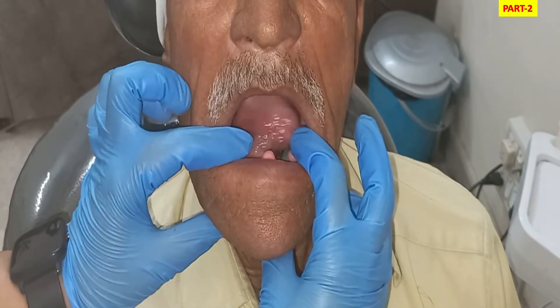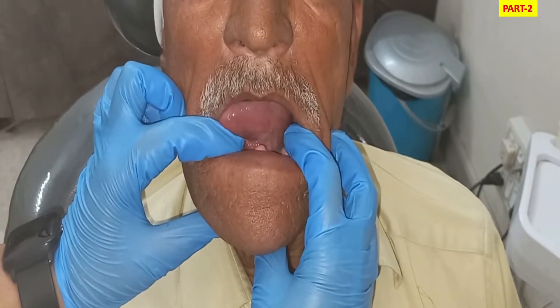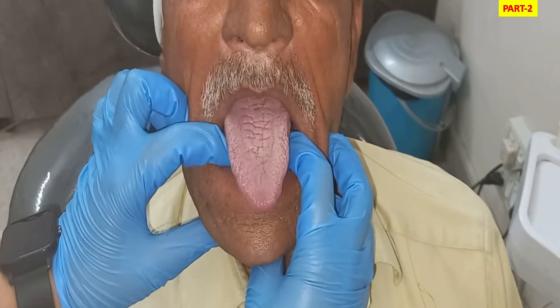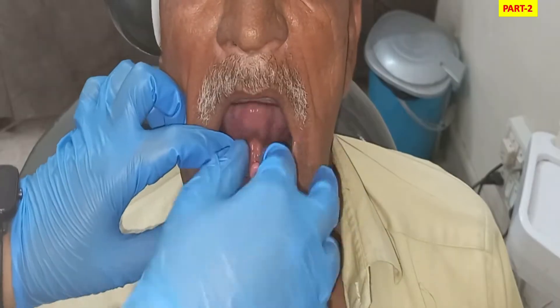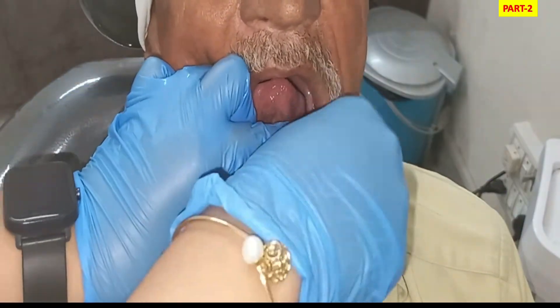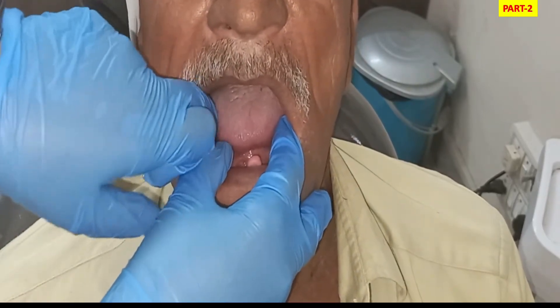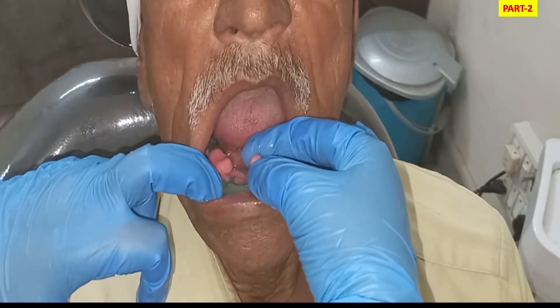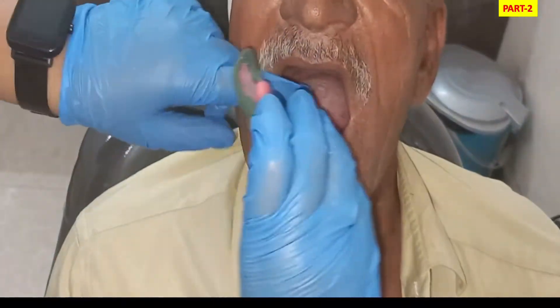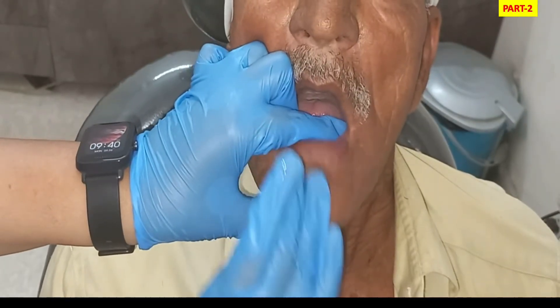We ask the patient to do tongue movements to record the alveolingual sulcus. The lingual extension is recorded by protruding the tongue, and then placing the tip of the tongue at the back of the palate to record the lingual frenum. For the middle and posterior parts of the alveolingual sulcus, we push the material with a finger to record those areas, then temporarily remove the tray to check the recording.